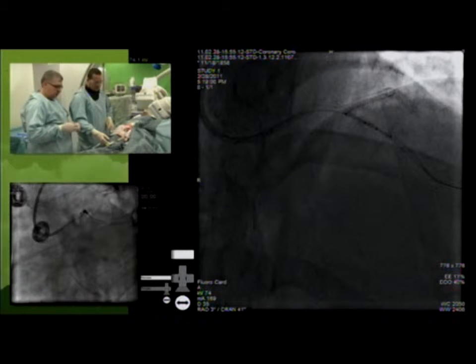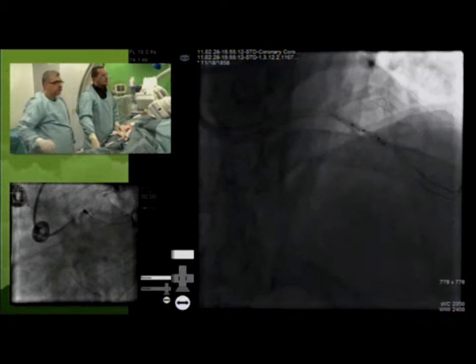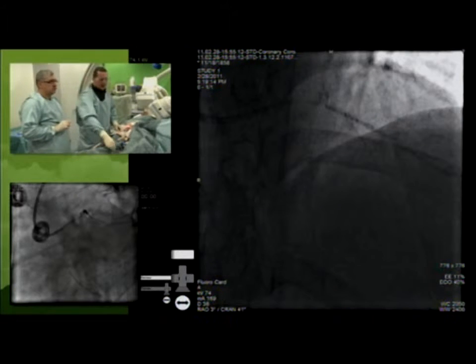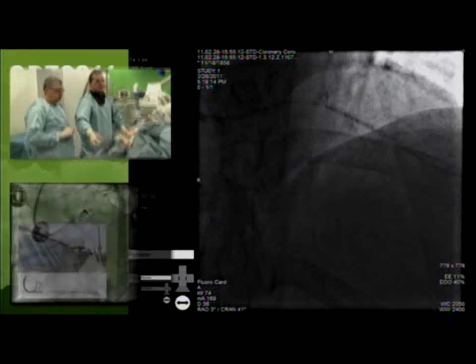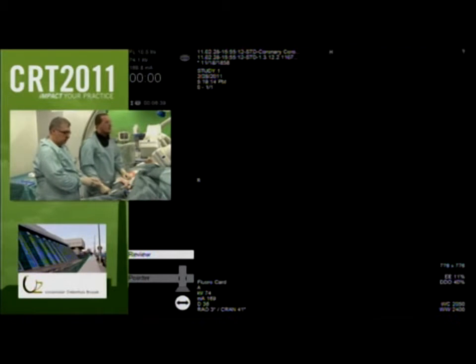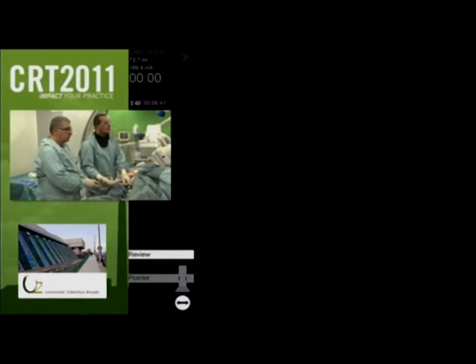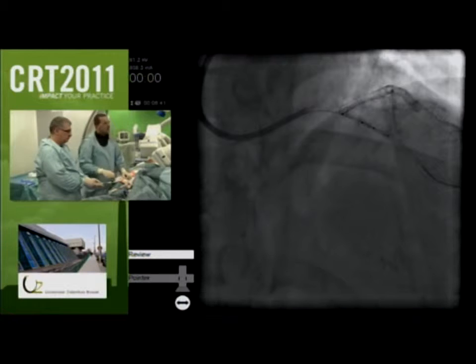You've pre-dilated, so show us what you're doing now. So we've pre-dilated, which I routinely do because the Tryton stent itself, going forward into the vessel, performs exactly like any other stent that you're used to. But given the design, if you have to bring it back into the guide catheter, especially through a tight lesion, there is not a lot of metal in the proximal part. So I tend to pre-dilate routinely before I put a Tryton stent in.